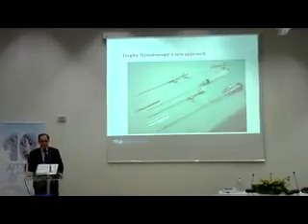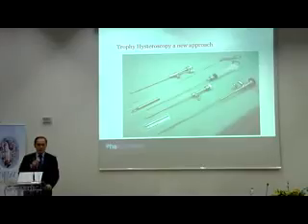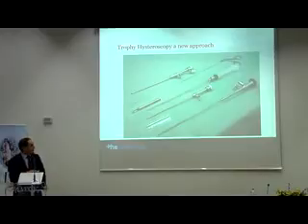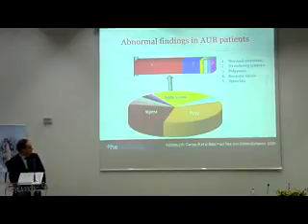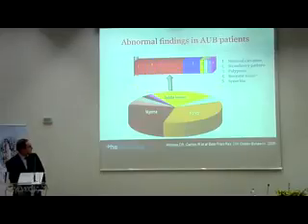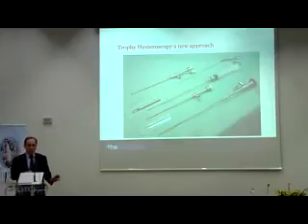So now how do we do it? We need new instruments, because to do what I showed you what we should do, the current instrumentation does not fulfill the task. We need a scope. It's an all-in-one scope, no shaft systems.